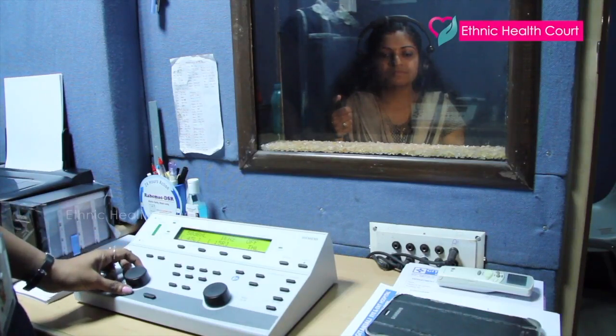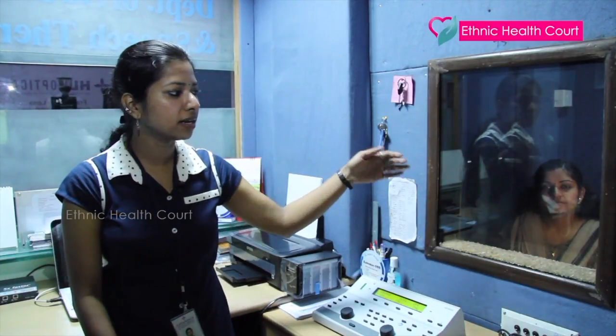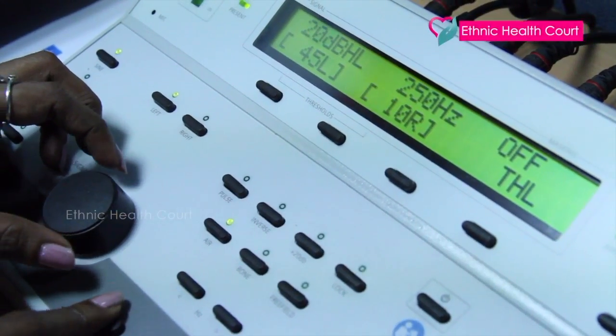We can test according to the audiologist's guidelines. How do we do a hearing evaluation? We have a two-room setup. We have a patient who is in this room. This is the audiologist's hearing evaluation.